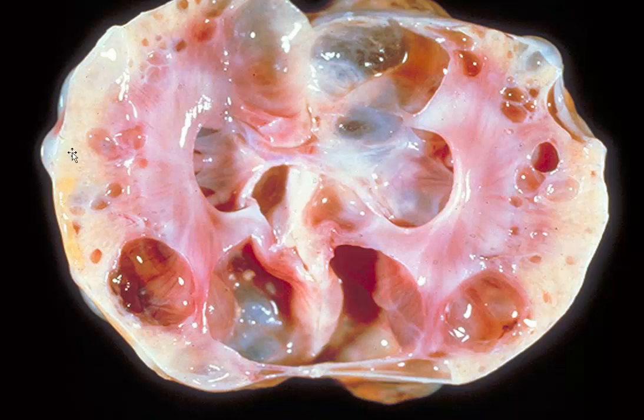You're not seeing the small cysts, but all these cysts are surrounded by fibrous connective tissue. And essentially, by the time the animal gets to this point, at 1 to 2 years of age, the cortex has been replaced by scar tissue and inflammation. There's no functional cortex. The animal goes into chronic renal failure. This is a very common appearance. This fibrosis and multiple cysts and sort of a shriveled kidney is very common with the autosomal dominant forms.